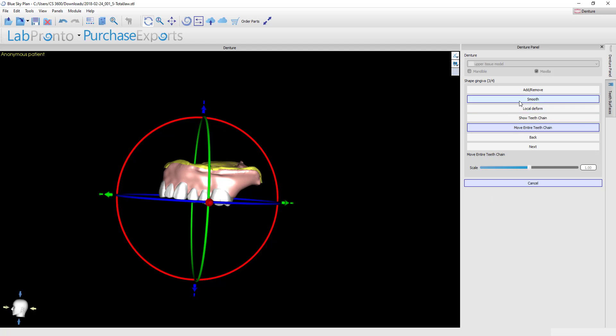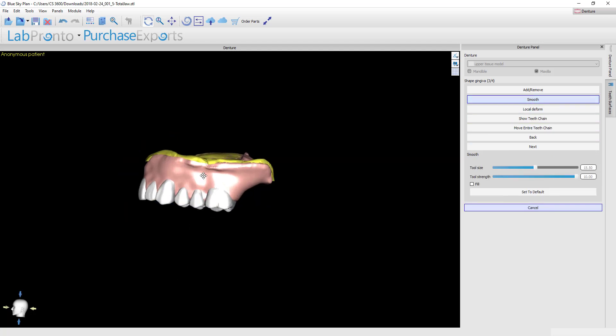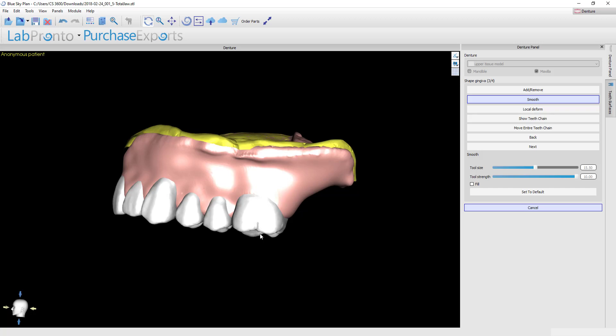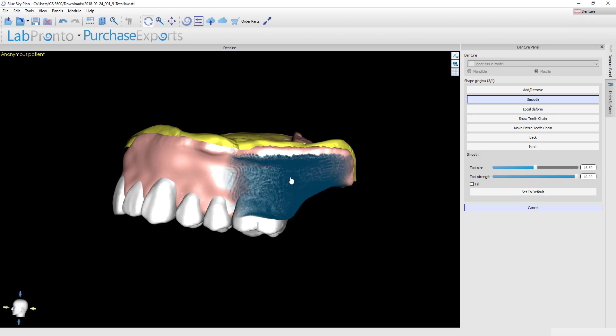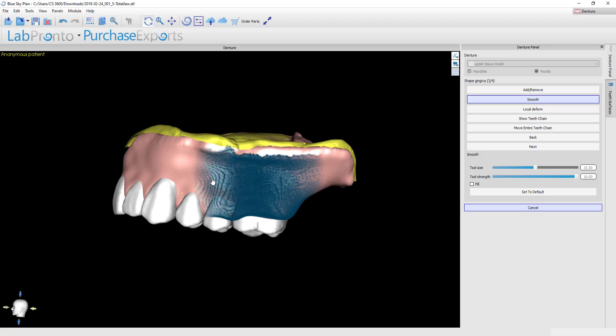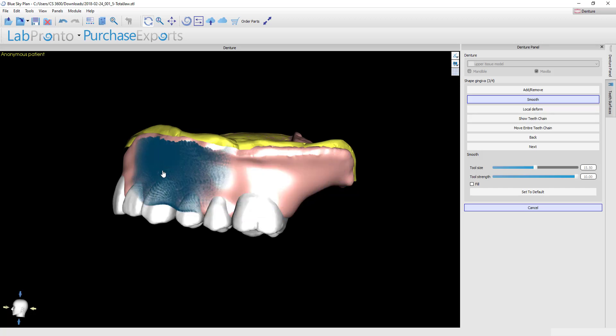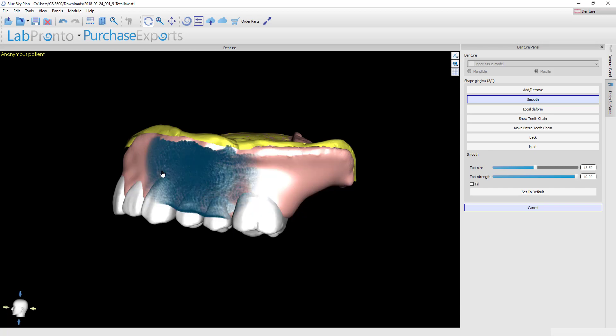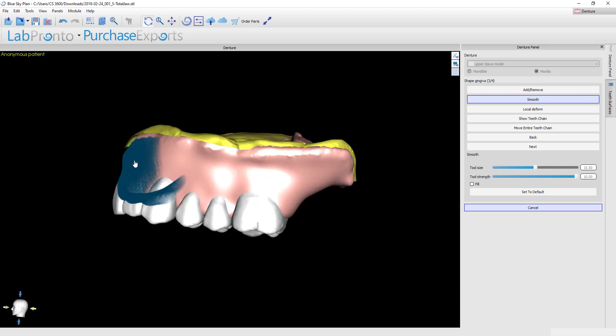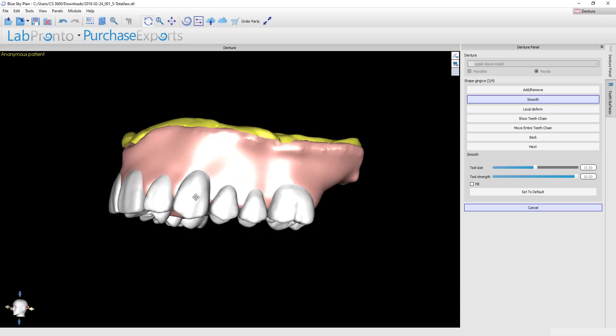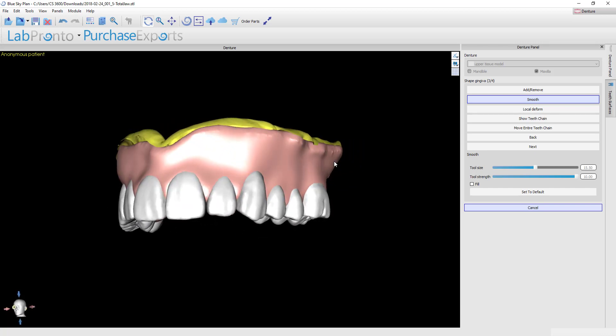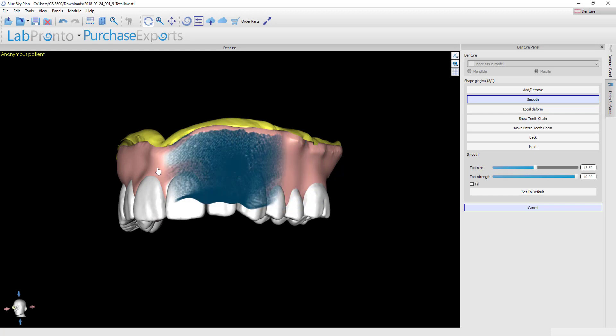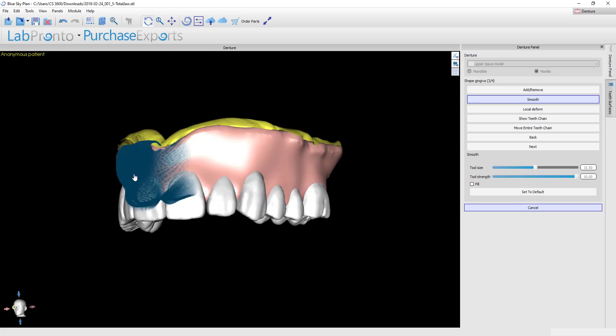I'm going to go back to the smooth tool and just give this denture a once-over and make sure that I'm happy with the overall festooning. I'll time-lapse this so that you don't have to sit here and watch me make every little change, but you'll get the big picture of how I try to go through the festooning process.